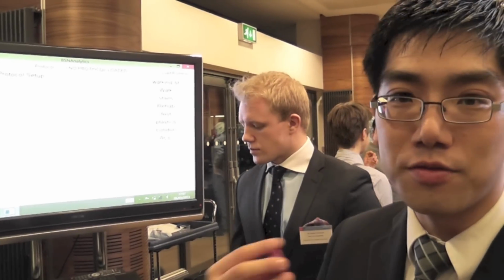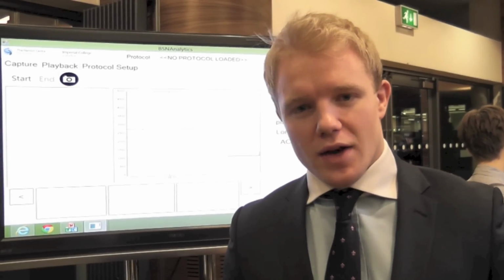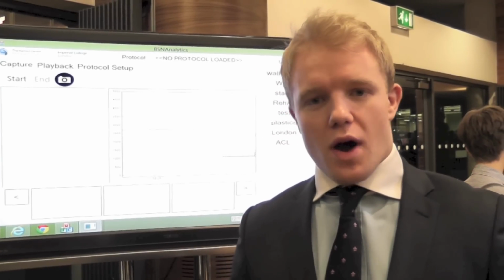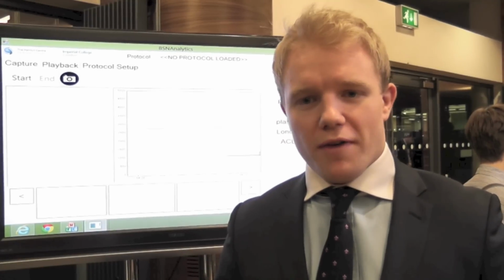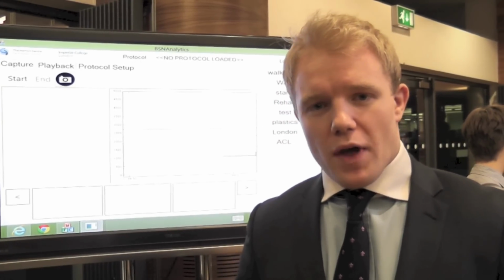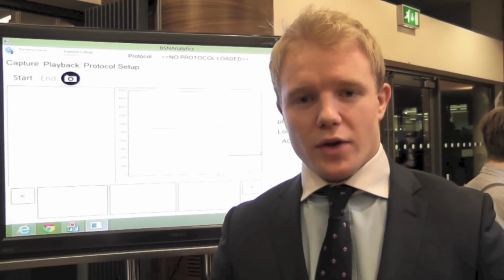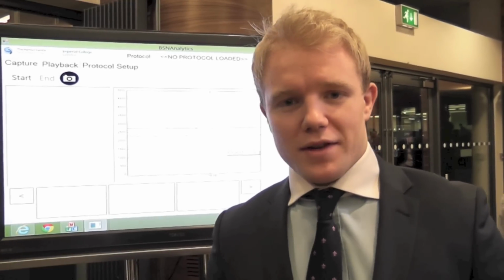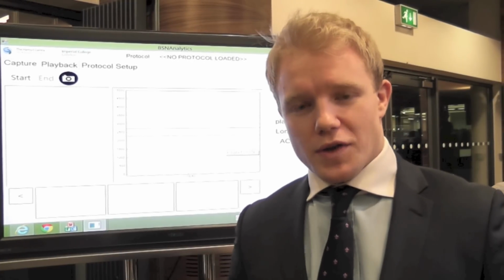So we capture movement of the wearer. So where this application is useful is really in rehabilitation and looking at prescribing exercise, just like you prescribe a tablet to a patient. Now often the patients after their surgery are followed up in a number of different ways, but they often say that they don't get enough feedback about their recovery process and how well they're doing, what things they should be allowed to do, can they get back onto the bike, go back to the gym or go back to work.